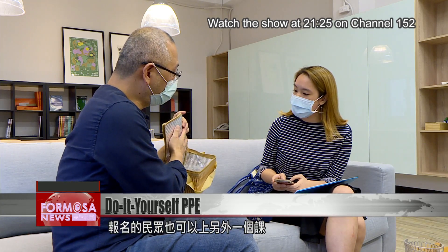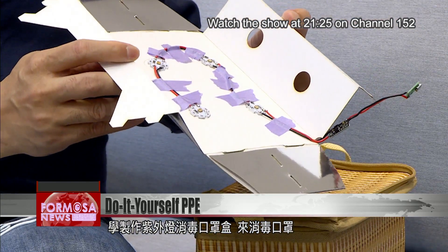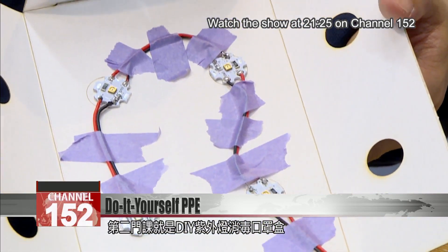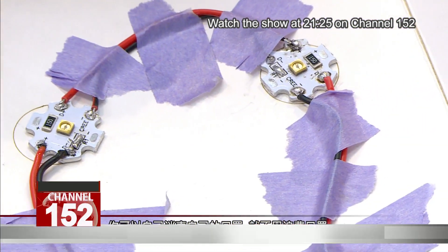Participants in the other workshop made their own UV light box, which can be used to effectively sanitize face masks. With a DIY UV light box, you can clean your mask by yourself so you don't waste a lot of masks.